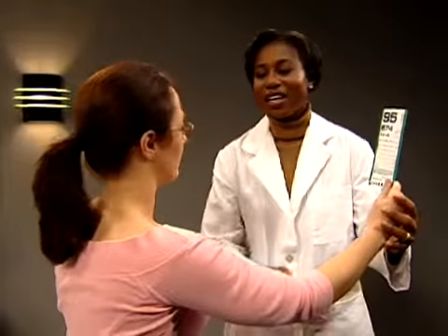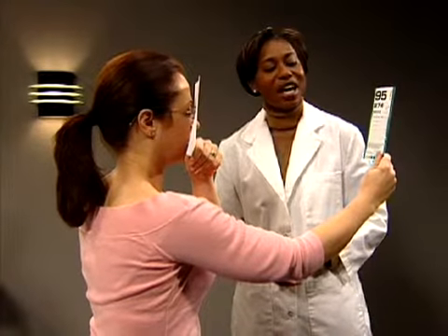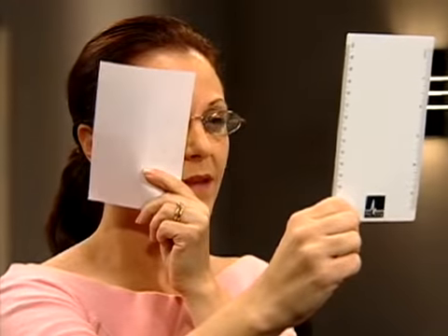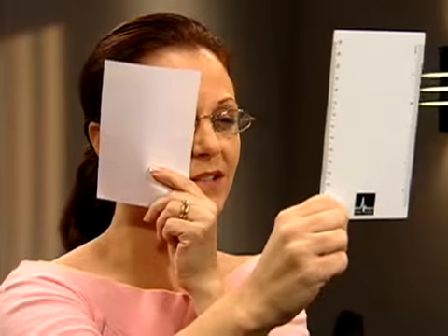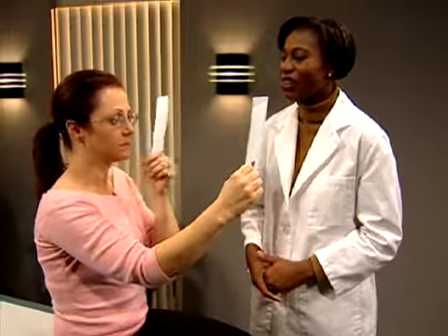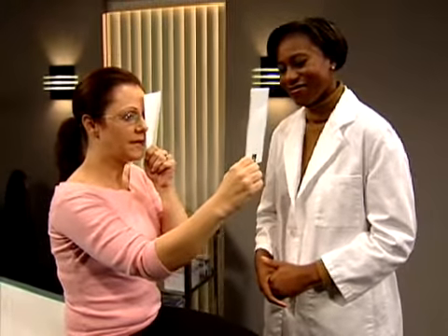Next, test the patient's near vision with a Rosenbaum pocket vision screener held about 14 inches from the eyes. Cover your right eye with the card and read the line with the smallest numbers that you can see clearly. Normally, near vision is also 20/20 in both eyes. Cover your other eye and read the smallest line you can see. Test the patient separately with and without glasses. 428739. Good. Now take off your glasses and we'll try it again.